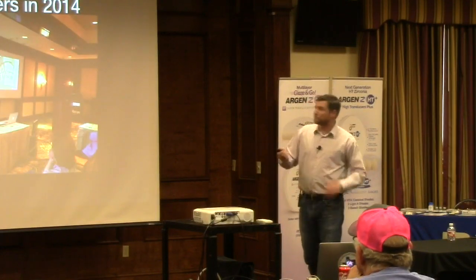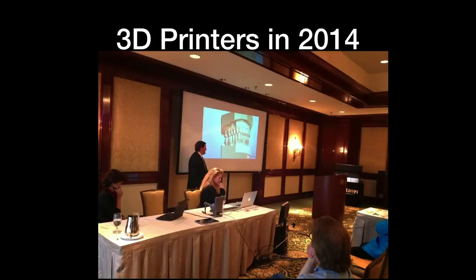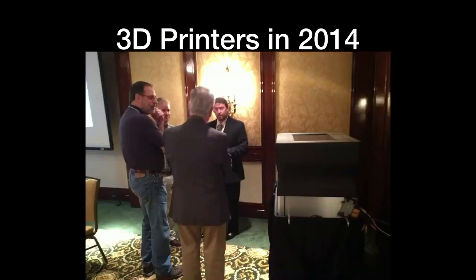And then we actually, in that 2014, you can't see it very well, we have to turn the lights off, but they're talking about models. We brought in this company called SculptCAD, and they were selling these object printers. And they were $40,000 for the printer that would print models that we could then make retainers on.